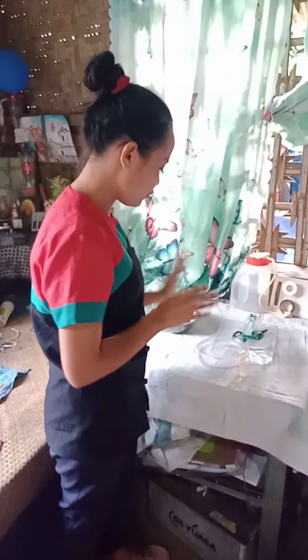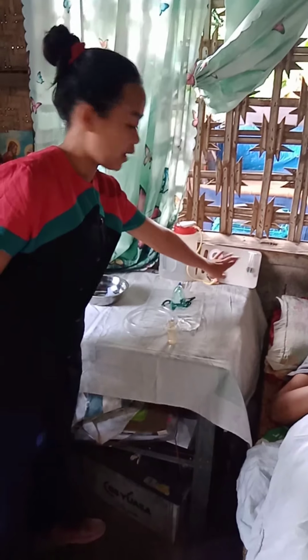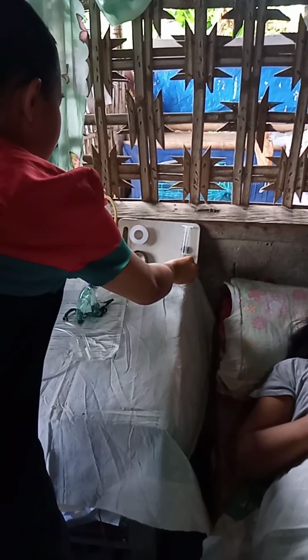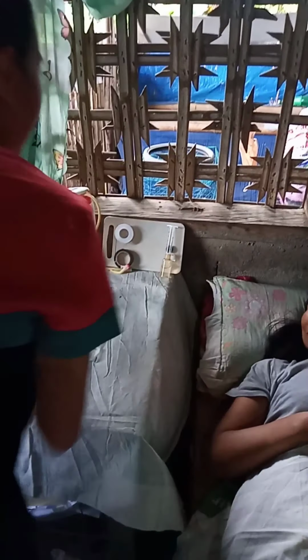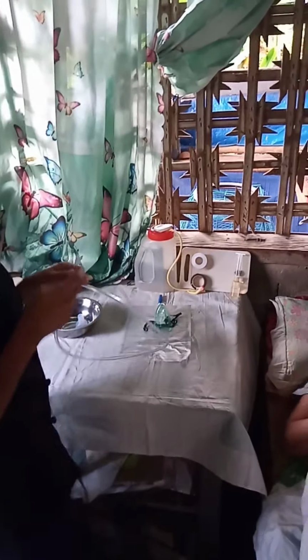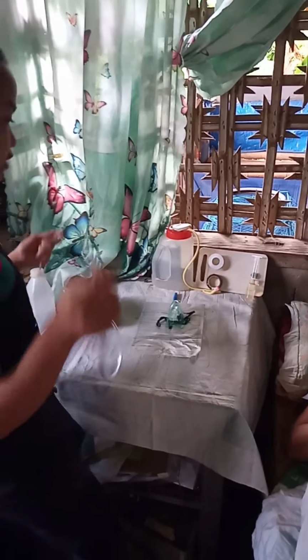Attach the humidifier and flow meter to the oxygen source. As you can see, we have here the flow meter already. Then we need to attach this. Then after that, it is time to attach the oxygen tubing and nasal cannula to the humidifier.